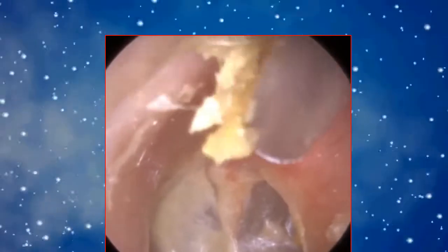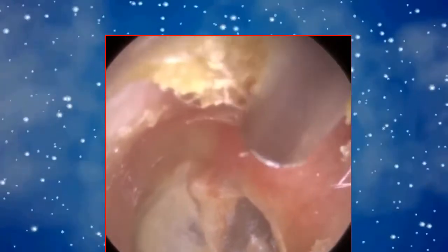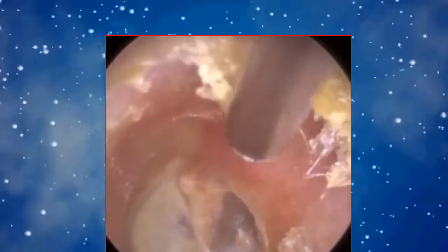So this patient's got very dry skin, wax. It's quite medial towards the eardrum. It does crust over. It's quite a satisfying type of consistency of wax to remove because it offers little resistance. When you put a suction probe and hover it over the wax, just like here, it just sucks without me having to do much work to maneuver and peel the wax off the canal wall. So this type of dry wax and skin is quite a satisfying one for a clinical ear care specialist to perform.